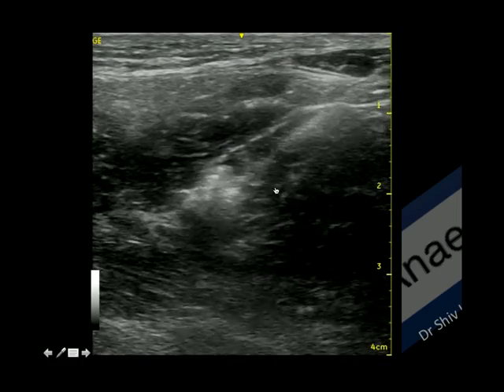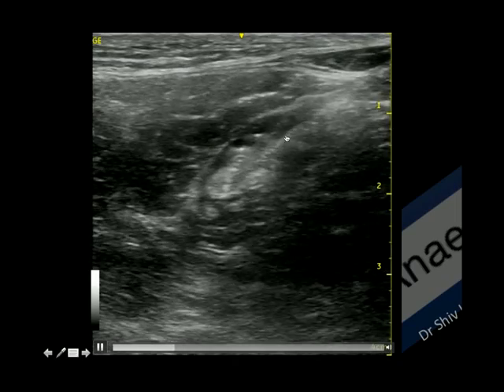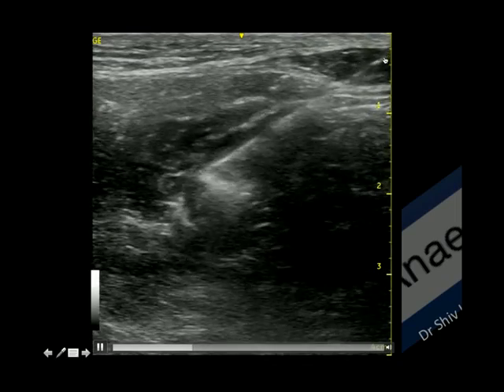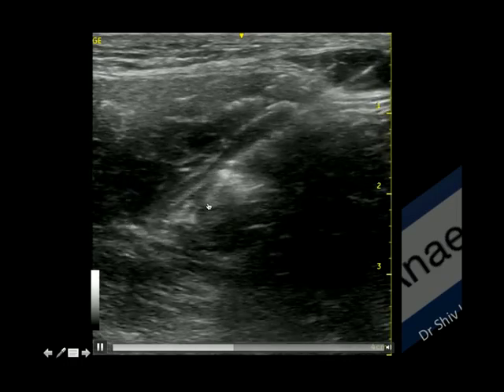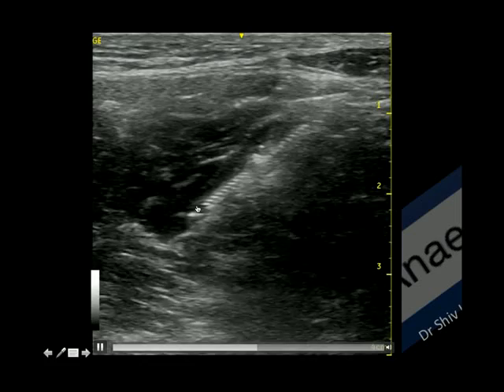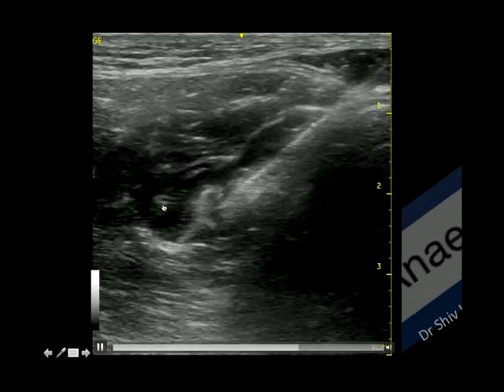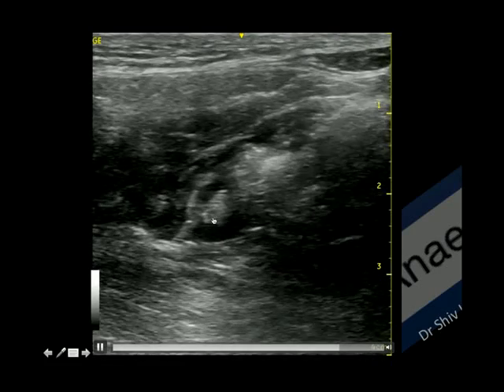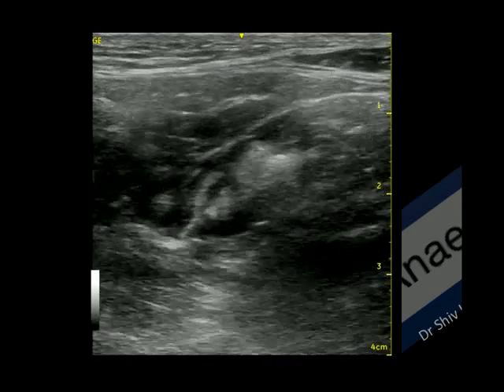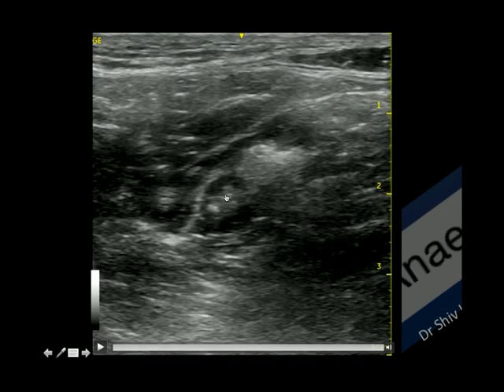This is a video of the same area showing the nerves supplying the posterior scrotal skin. You can see the fascia lata and the various fascial layers. The needle approaches anteroposteriorly and you can actually see multiple nerve branches in this video. We are trying to deposit local anesthetic around the nerves. Toward the end of the video more branches become visible. You have to aspirate regularly while administering local anesthetic, because there are branches of vessels present alongside the perineal nerves.